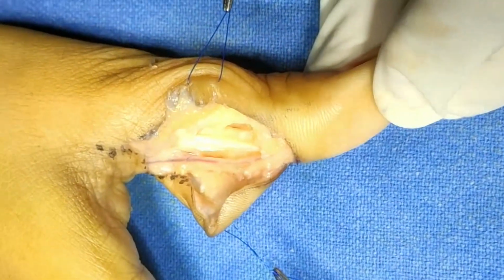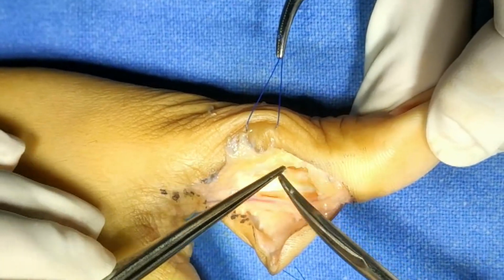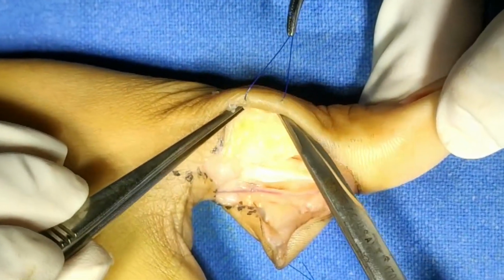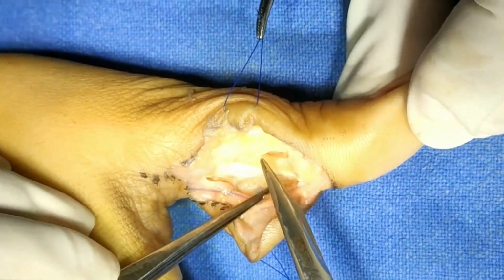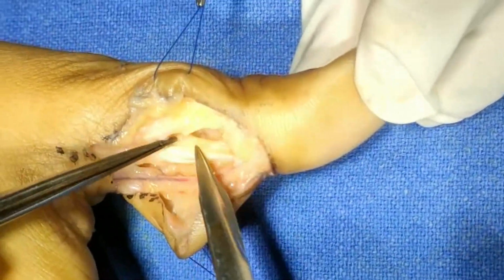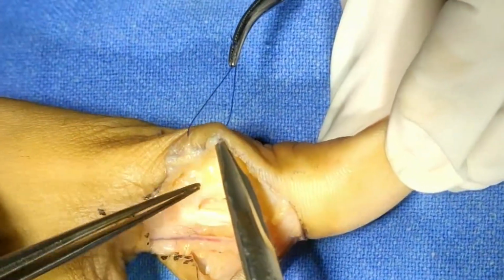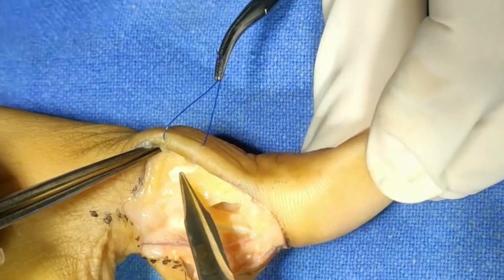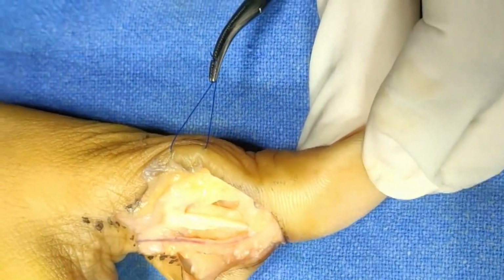Now I will see, trim it out. So I think I have removed it. There is nothing left behind. It's all clean. Now this is the bone here, and there is resorption of the bone. This deep part was in this cavity. This is the tendon, this is the neurovascular bundle on this side, and these are the extensor tendons, right? Now this operation is complete.